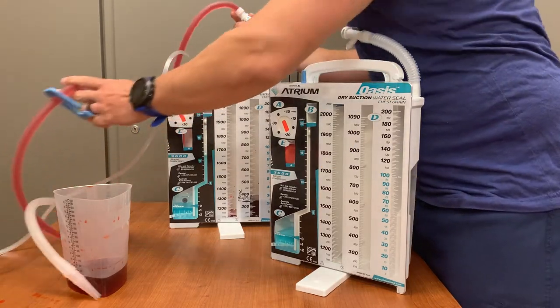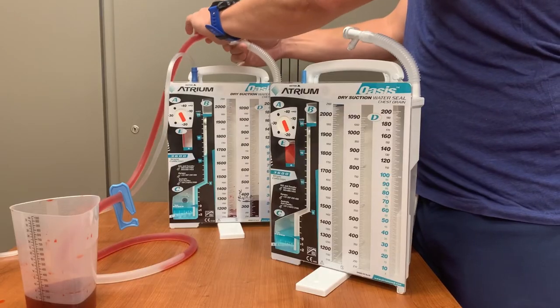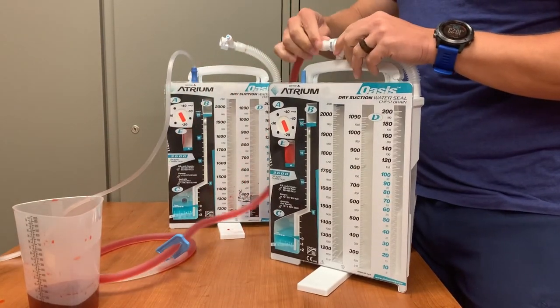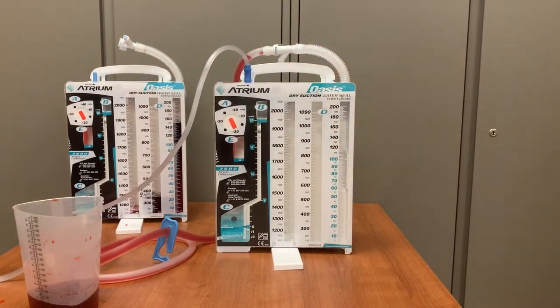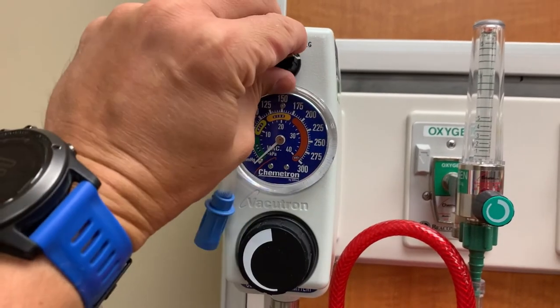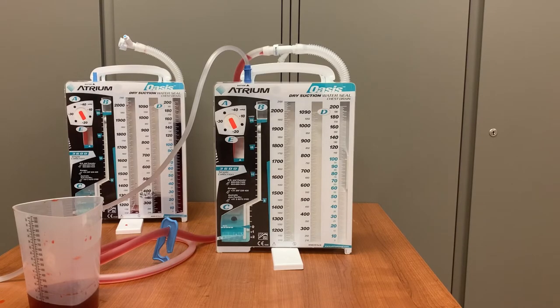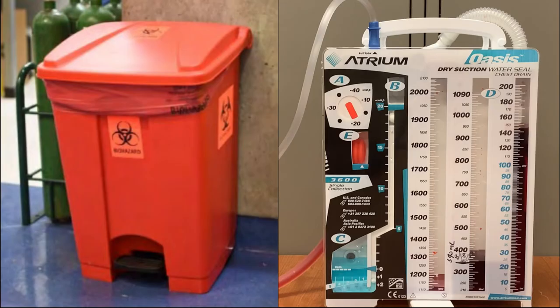First, clamp the tubing going from the current Oasis unit to the patient. Turn off the wall suction, then detach the tubing at the inline connection and insert it into the connector for the new Oasis container. Next, move the suction tubing from the old container to the new one and make sure the suction settings on the new Oasis match that of the previous unit. Open the clamp on the tubing going to the patient and then turn on the wall suction. Ensure that the bellows are inflated. Before disposing of the old Oasis, document the amount of drainage in EPIC, then put the old Oasis container in the biohazard bin. It is not intended to be emptied before disposal.